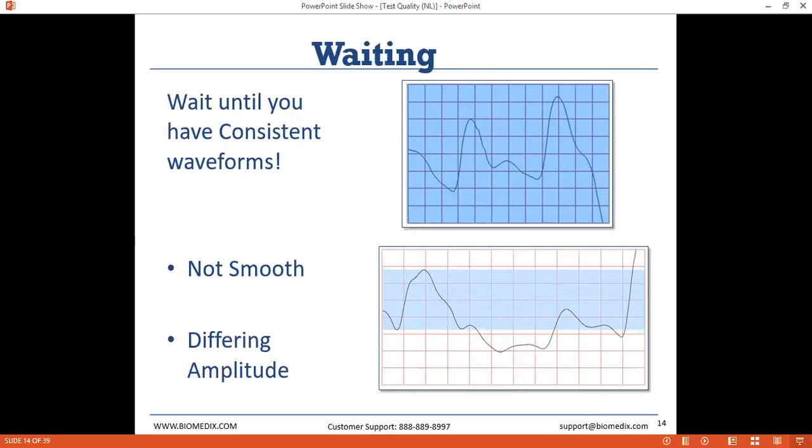And so you'll see waveforms that climb across the screen or descend across the screen very, very early. Again, it should take 5 to 10 seconds or so before the waveforms appear, and it may take another 5 seconds or so before those waveforms settle down and become nice and even like we're looking for.